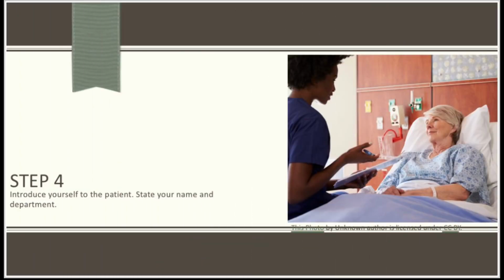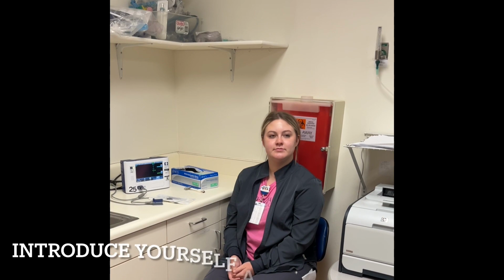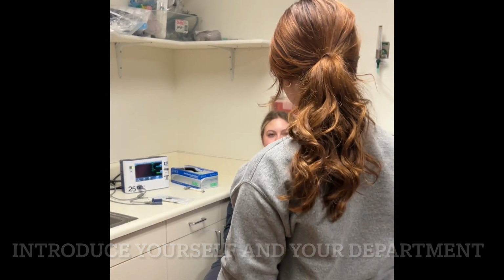As you walk into a patient's room, you should always introduce yourself to the patient by stating your name and your department. This is also when you should ask the patient for their name and date of birth. Hi, my name is Emily. I'm from respiratory. Can I have your name and date of birth?